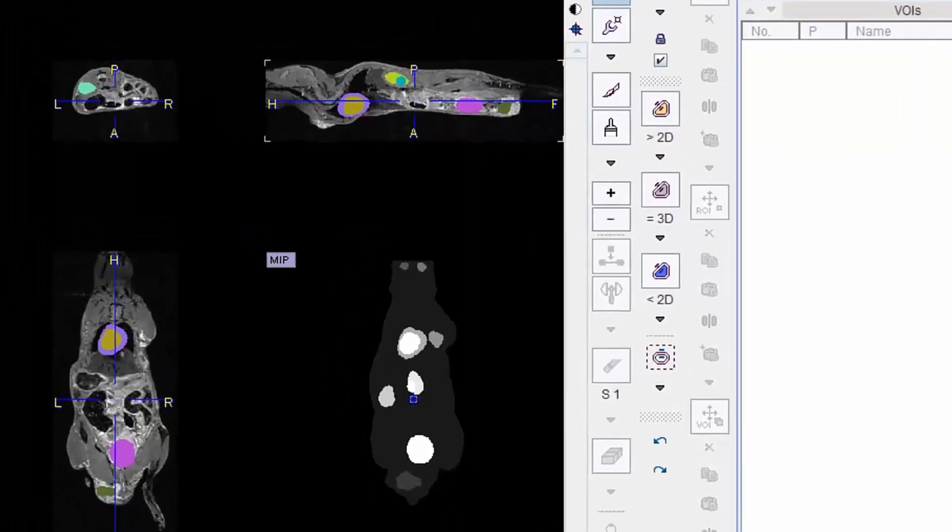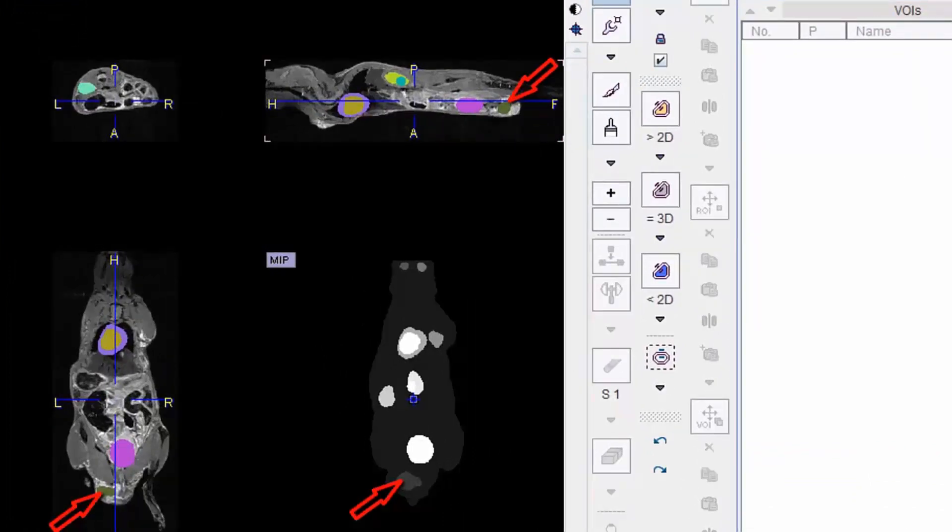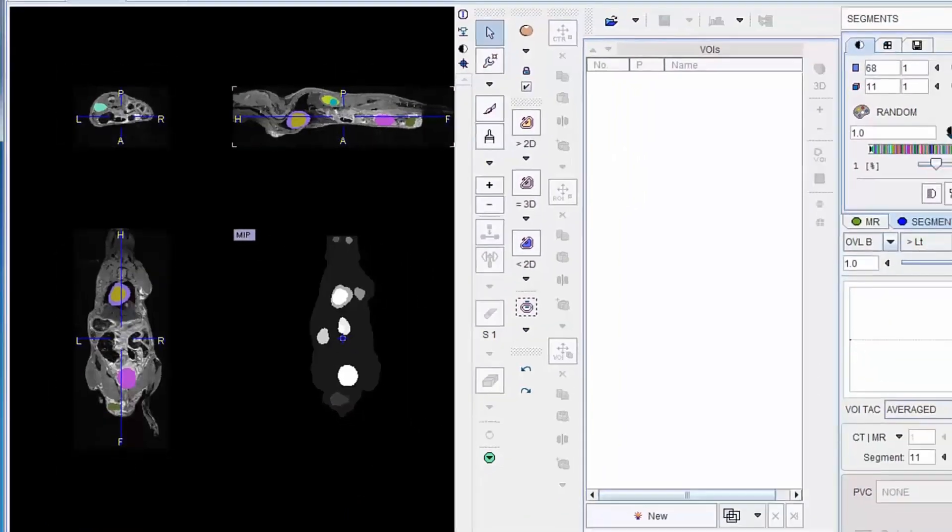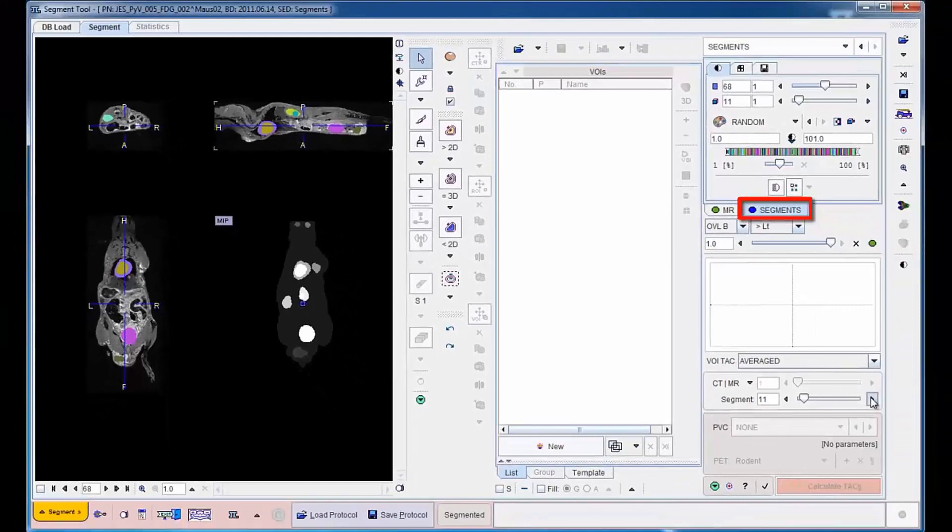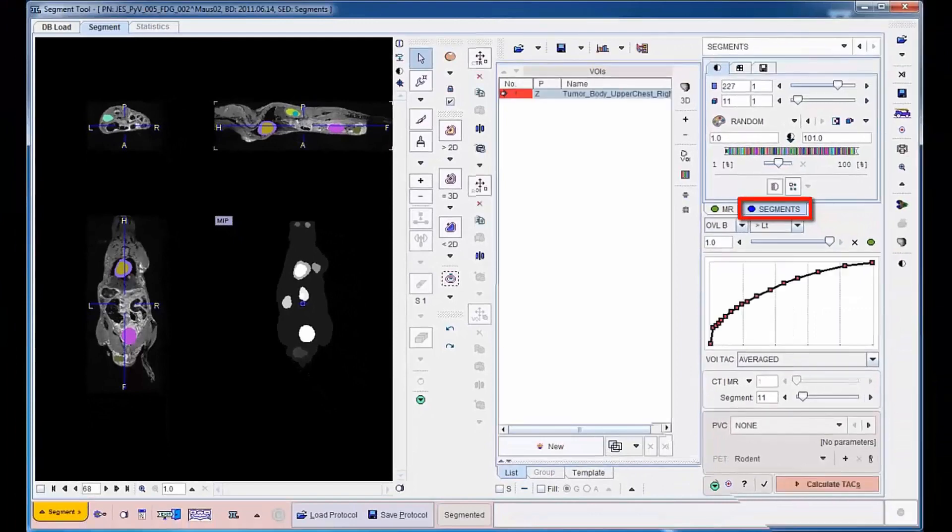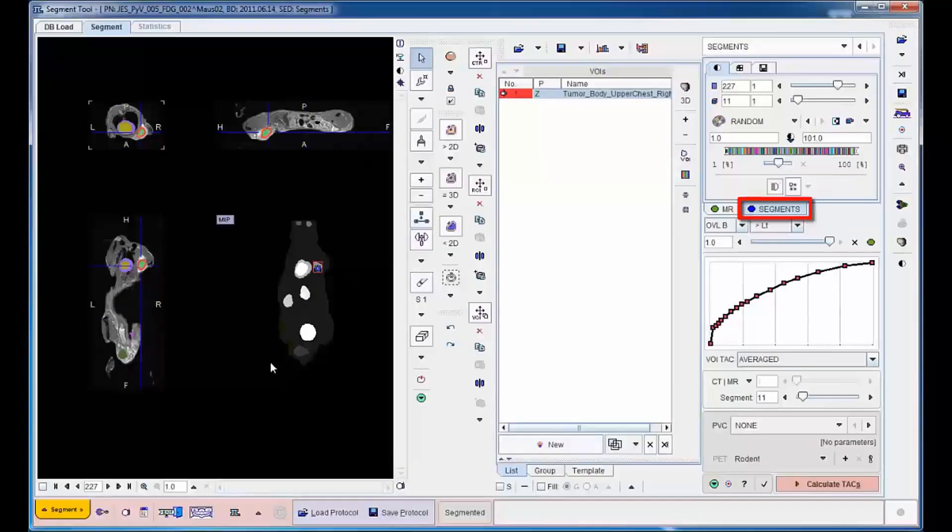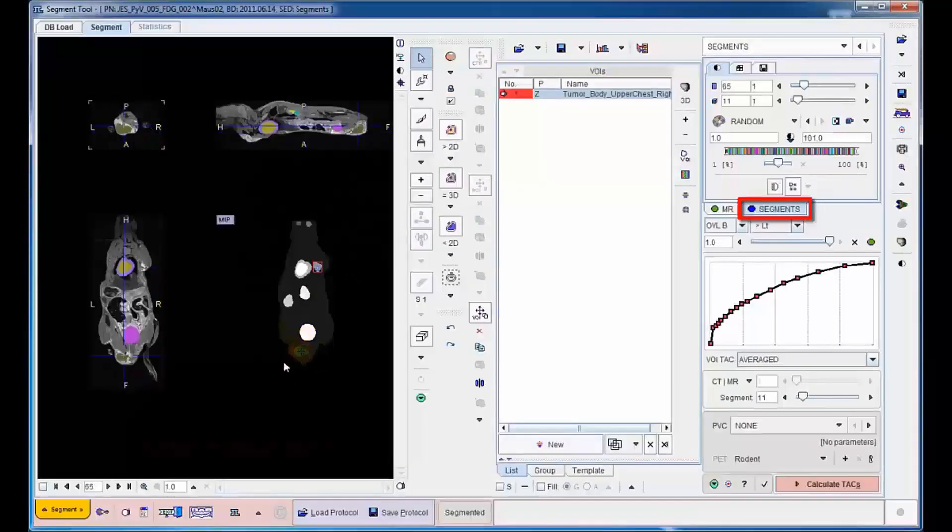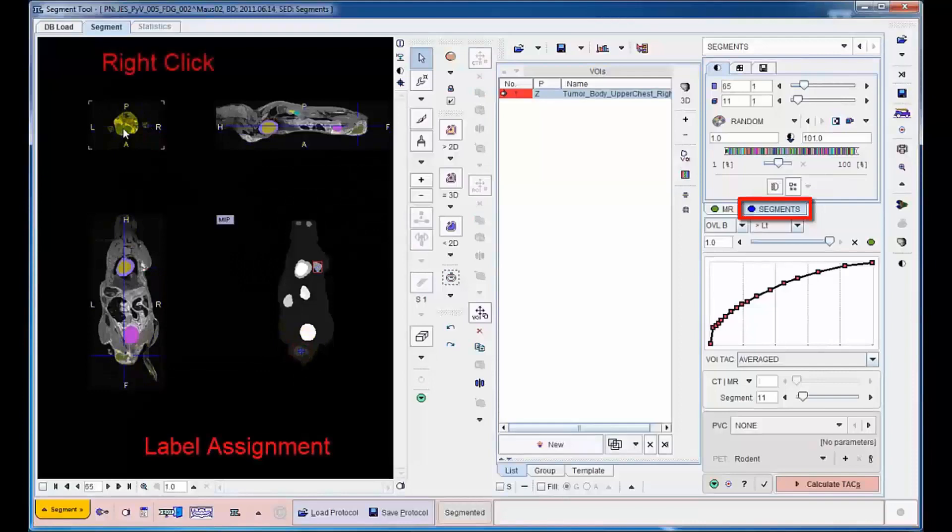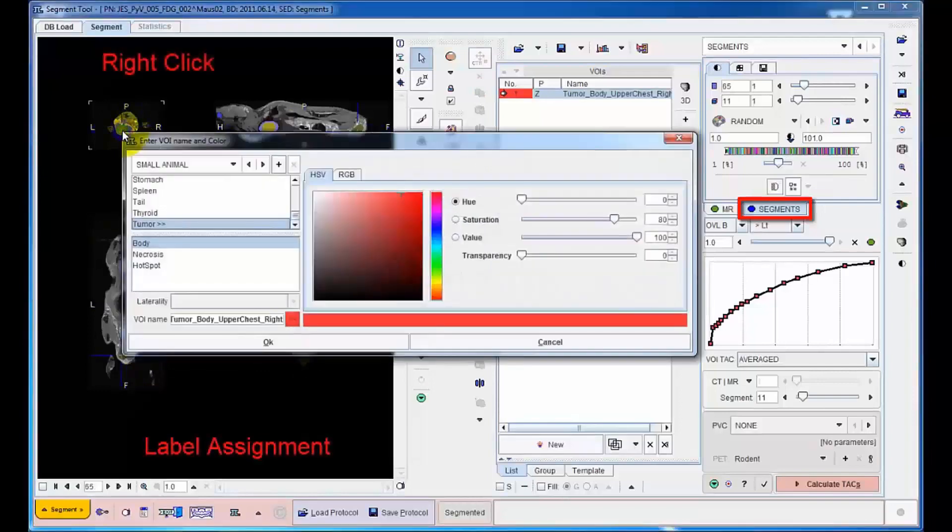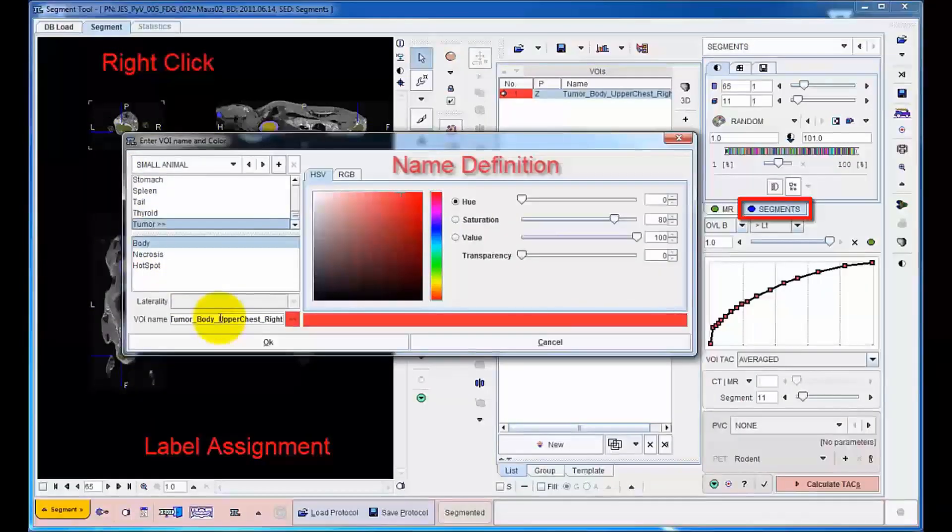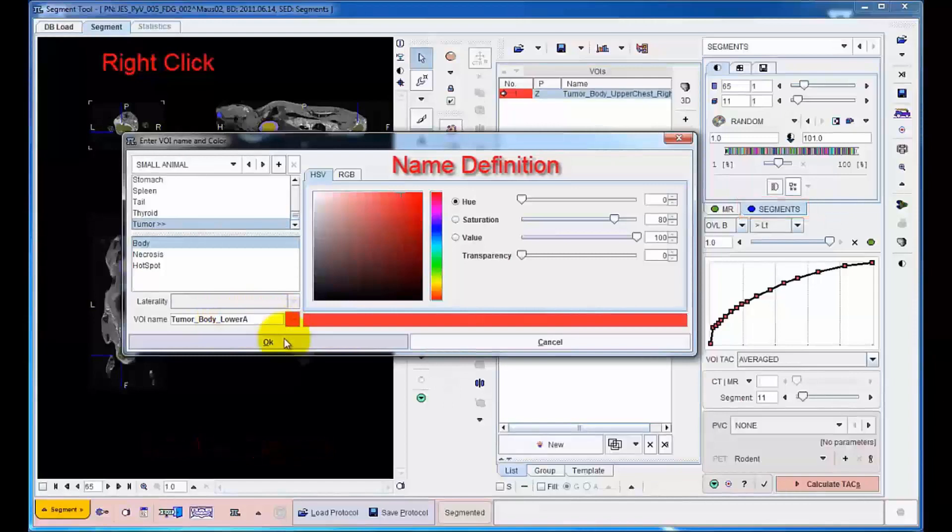Our example includes three tumors which have increased contrast in the MRI. The segmentation level is gradually increased until a segment corresponds to a tumor. This segment is then labeled and converted into a VOI by simply right-clicking and selecting a label in the customizable lists.